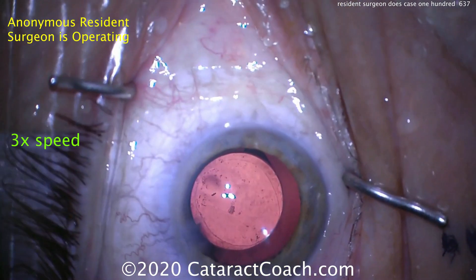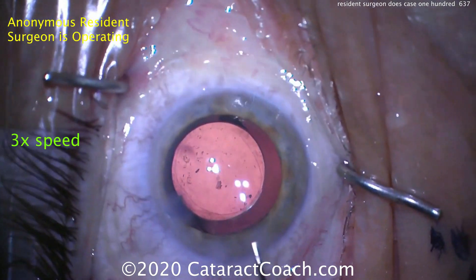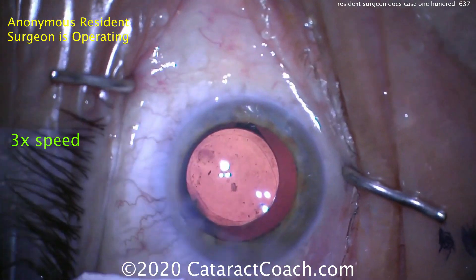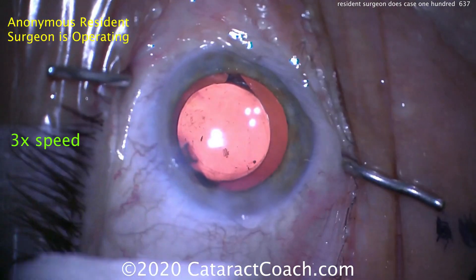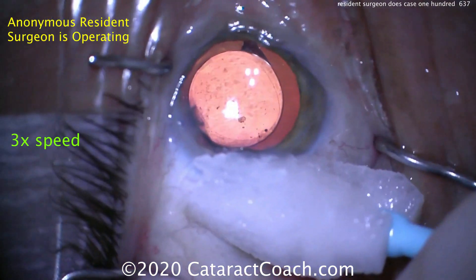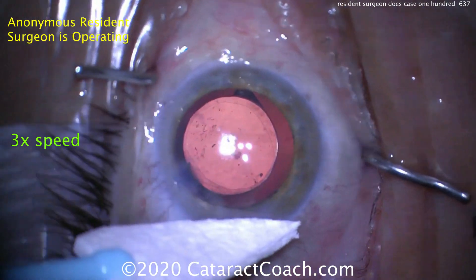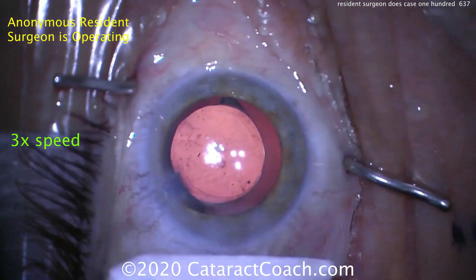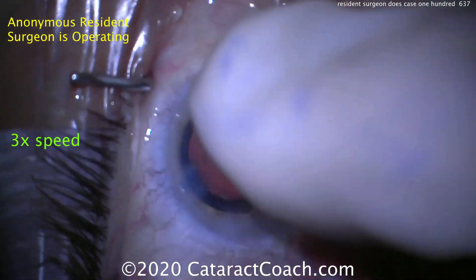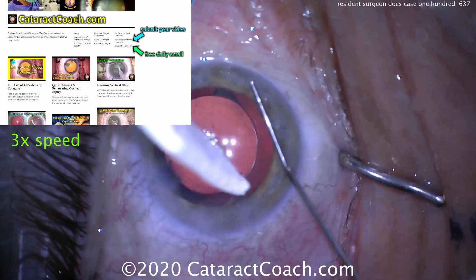And that does look great. Sealing up the incisions — I'll take it. Beautiful job. So in summary: very nice surgery. Good incision, good draping, good capsulorexis. I like the nucleus division technique. Time for you to graduate to doing stop and chop, and then hopefully move on to just pure phaco chop. Also tell your anesthesiologist next time to be a little more generous with systemic sedation. Thanks for submitting your video — it really was great, and you're going to do a beautiful job in the future.